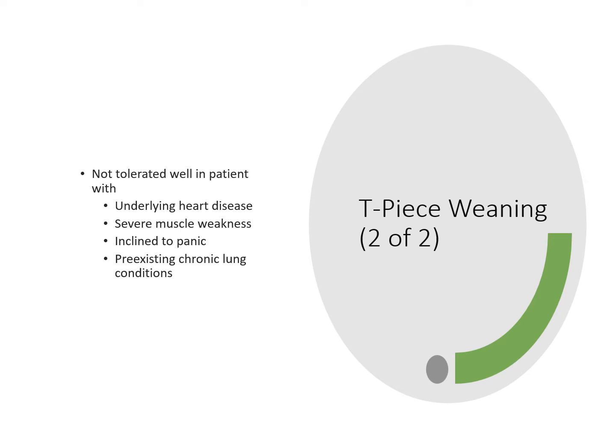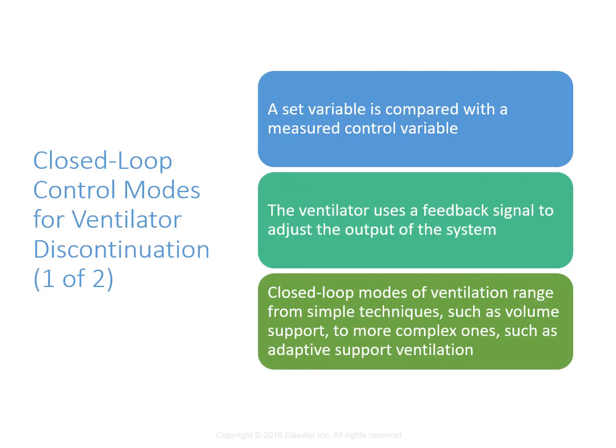That really helps us see if their hearts are healthy enough to take them off yet. So it's a good idea, if one way doesn't work and it's not successful, to ask, hey, what are the thoughts of trying another way? Because these reports are conflicting, but as long as the staff members are in agreement and they all know how to wean in these modes, then that's where I think these things can show their different value to different patients that have failed multiple times.